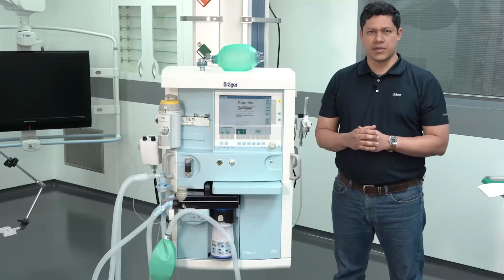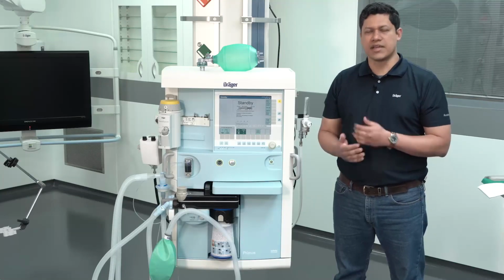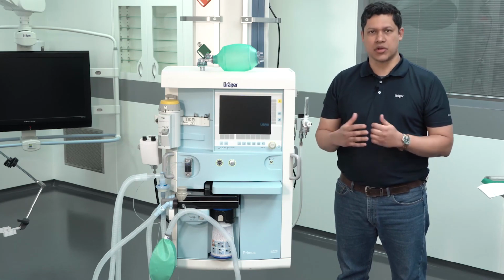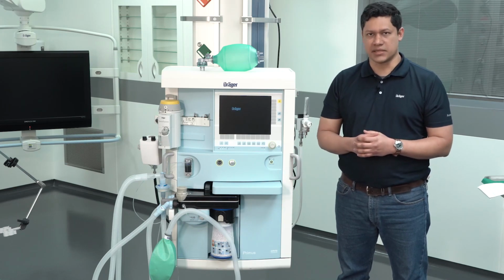The intention of this video is to provide medical personnel with an overview of the use of the anesthesia device for long-term ventilation. Medical personnel should be instructed on the use of the medical device and get familiarized with the functionalities of Dräger anesthesia devices.